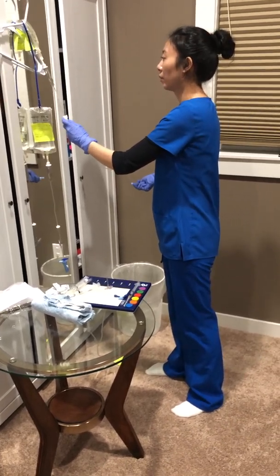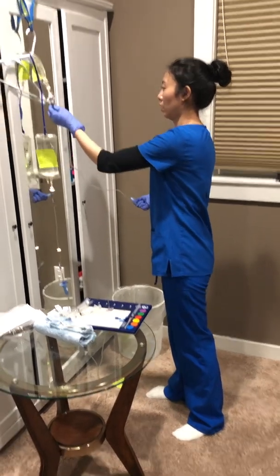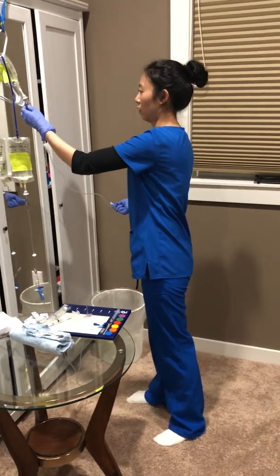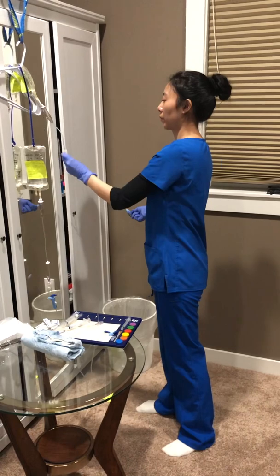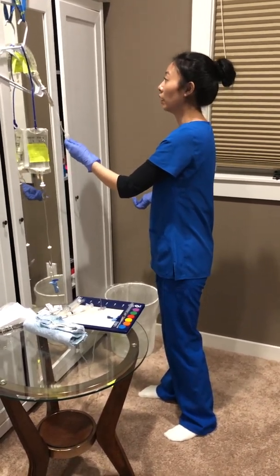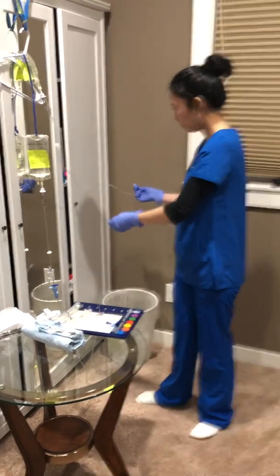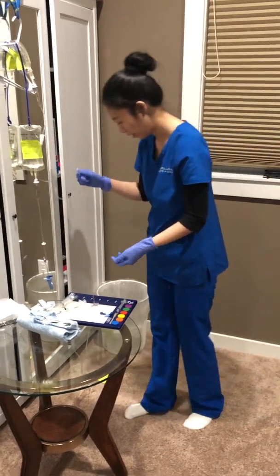Open the clamp. Okay. Good. No air bubble in the line, and I set it to 34 drops per minute because I have to give it in 15 minutes.